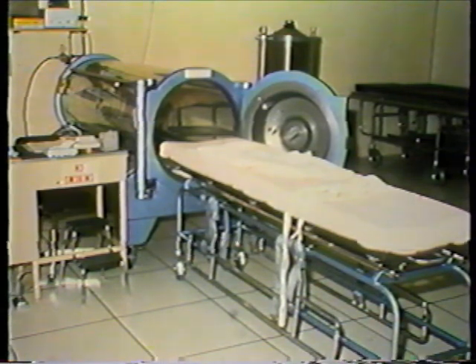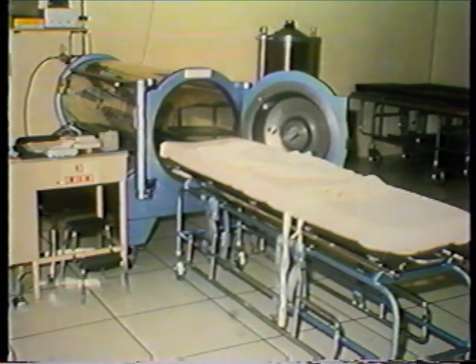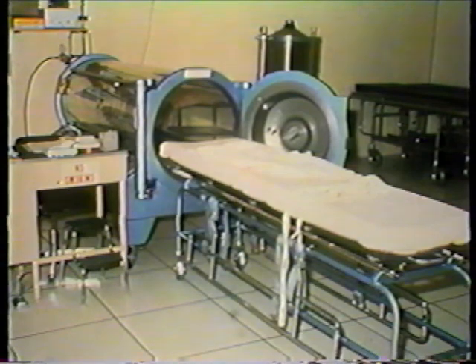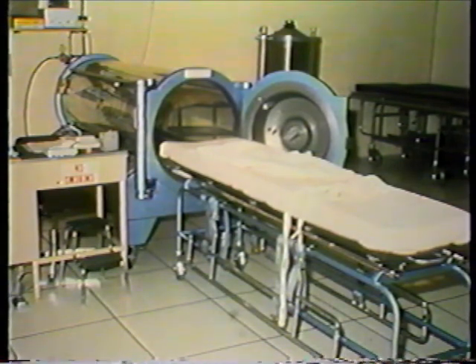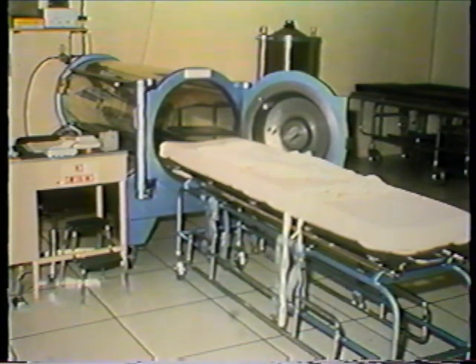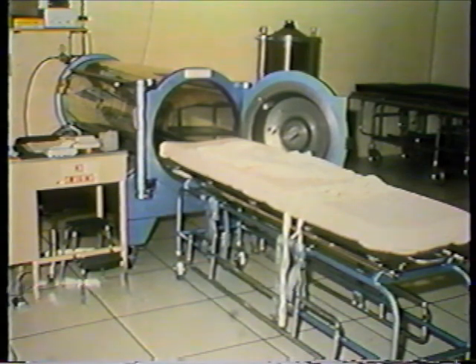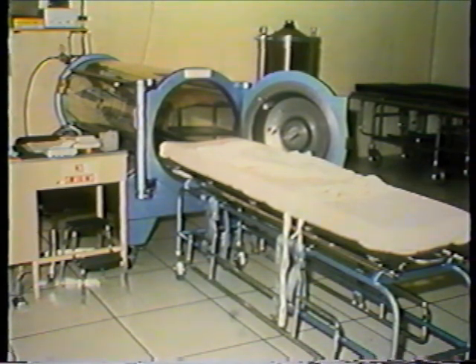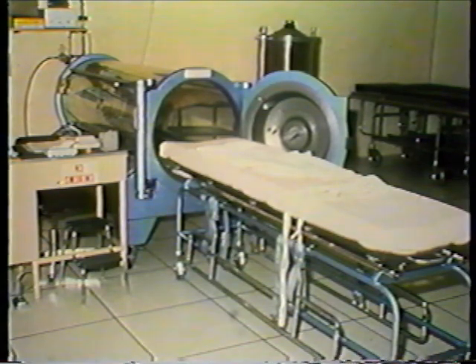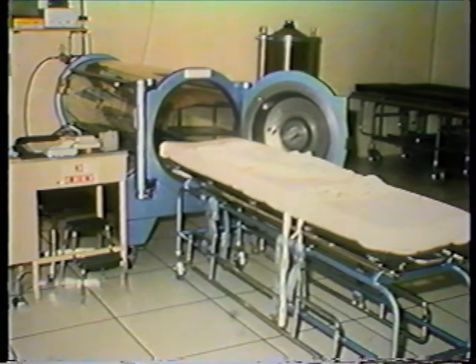It is possible to introduce IV lines through the door, and IVAC pumps can deliver continuous intravenous infusions into patients during treatment. A bolus of medicine can be given as necessary. Monitoring can be carried out — blood pressure, EKG, or whatever. An arterial line can also be used, and one can externalize the arterial line to draw arterial samples if desired. This chamber is also fitted with a ventilator which fits inside the door, so even the apneic patient can be successfully managed in the mono-place chamber.